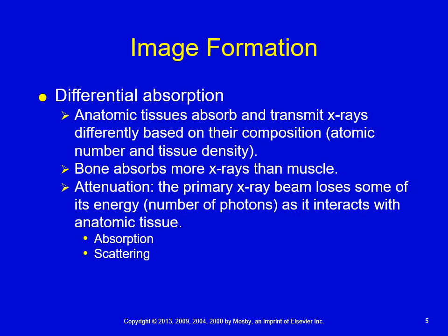So the different body parts are absorbing the X-ray beam differently. Body tissues that absorb the X-ray beam more readily are things like bone, because they're more dense, and body tissues that allow the beam to go through more easily are things like our air-filled lungs.